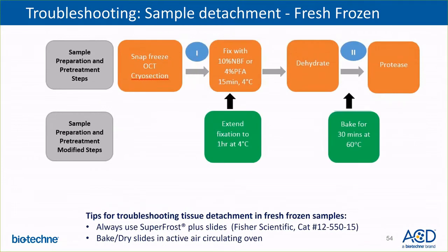With the fresh frozen samples, we recommend to extend the fixation if you're observing tissue detachment, and you can extend to up to an hour. Additionally, we can add a baking step after the dehydration of the slides.